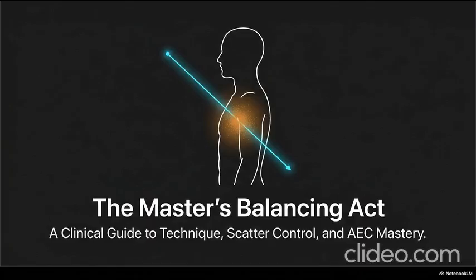Very true. Diseases fundamentally alter how tissue absorbs X-rays. Right, like additive diseases. Pneumonia or pleural effusion, they flood the lungs with fluid, making them vastly denser and harder to penetrate. Exactly. And destructive diseases like severe osteoporosis or emphysema eat away bone density or trap excess air, making the tissue much easier to penetrate. And the AEC just blindly reacts to whatever radiation passes through. Yes, meaning the radiographer has to deeply understand the patient's medical history to anticipate how the machine's autopilot will behave.